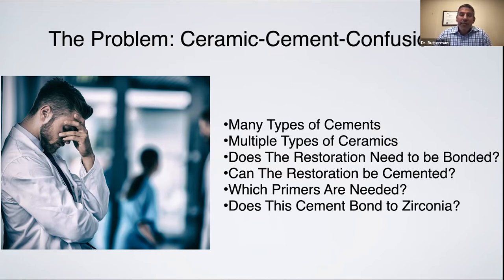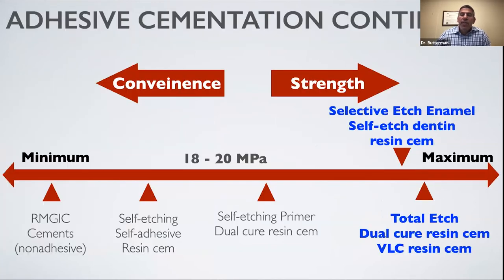So I asked for clarification. I'm like, "What are you talking about, Patty?" She said, "Well, we've been doing crowns forever, but now with CEREC, since you started using that, I've had a ton of patients calling with sensitivity, and it's really getting annoying because these patients are calling and they're sensitive. And I need you to stop it." So the issue is it's complicated and you can have these problems with sensitivity because there's so many different steps. There's so many different procedures to do. And when you're new to bonding, that's when you can kind of have these sort of issues.